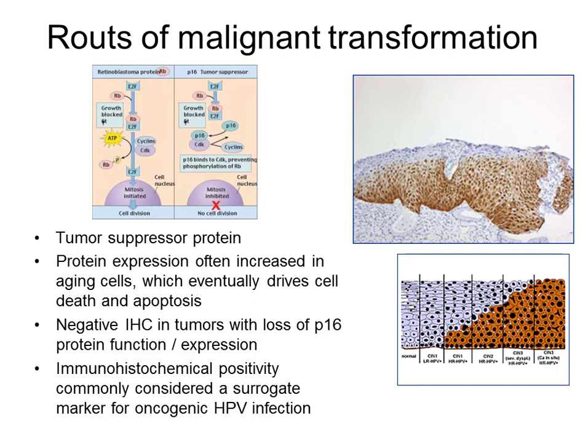And if we see cervical intraepithelial neoplasia in a woman, we may use this marker P16, and if it gives a positive staining, we know that this woman has HPV infection, so it may very often transform to cancer, to a malignant tumor of the cervix.